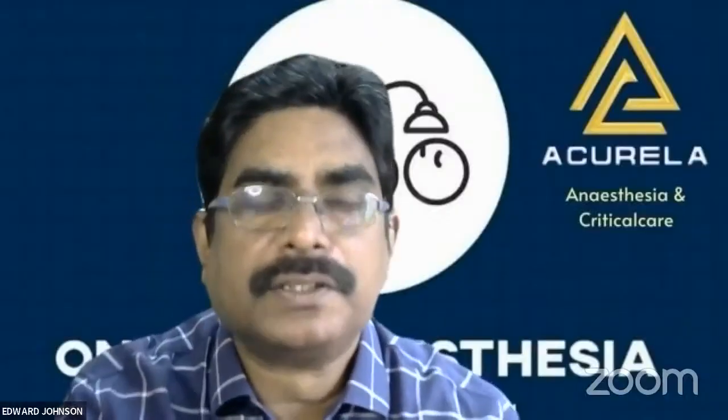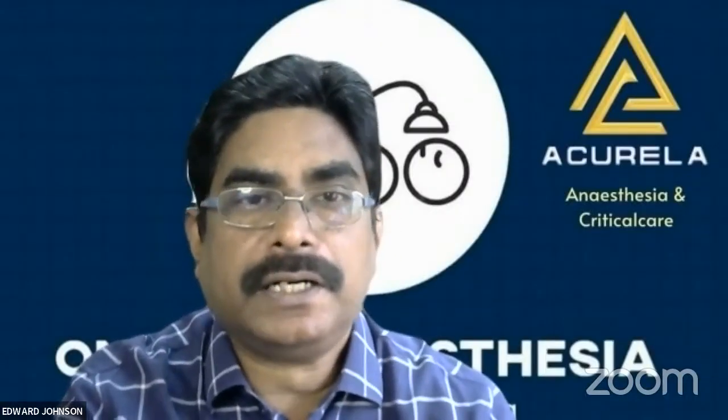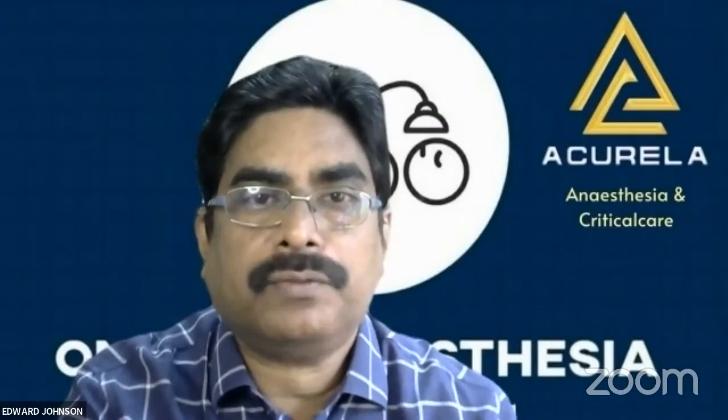Okay, sir. My question is, in diastolic dysfunction, can we do a fluid challenge test, sir? Yeah, there's something called a FALLS protocol. That is your fluid administration limited by lung sonography.